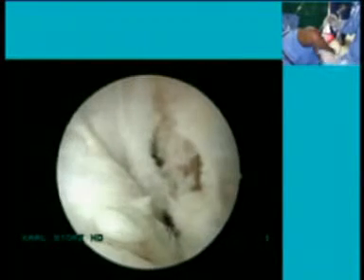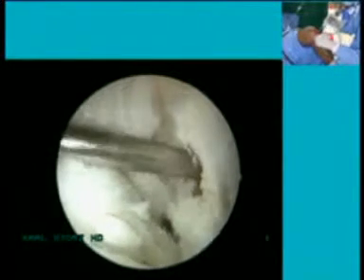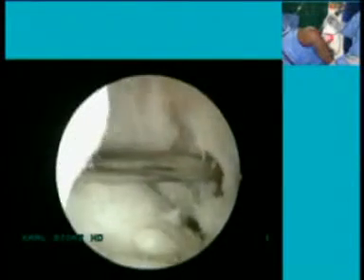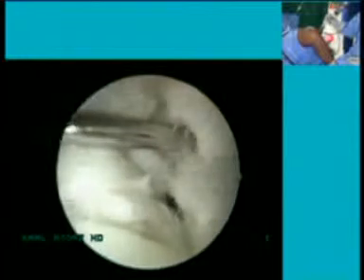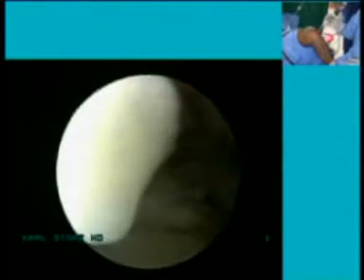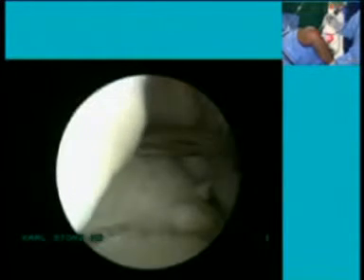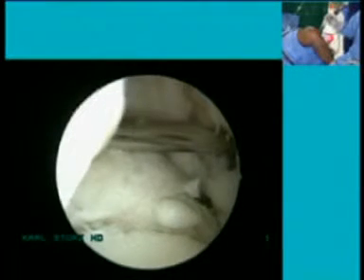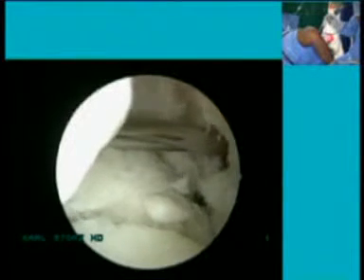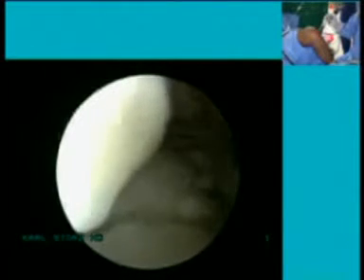Okay, now I drill the tunnels. Raj, the question is, are they doing a tripling of both the grafts? Dr. Wolf, the audience would like to know, and the panel would also like to know, how you have prepared your grafts for the AM and the PL. Can you quickly show the grafts for both the tunnels?